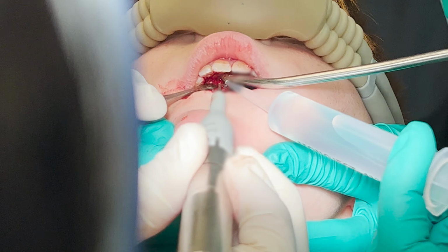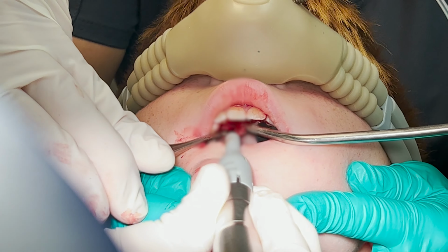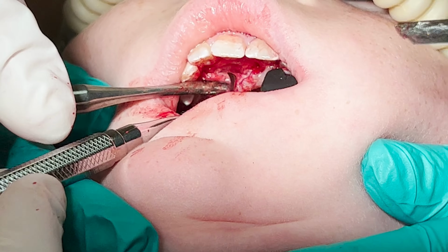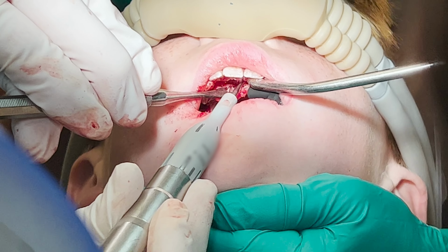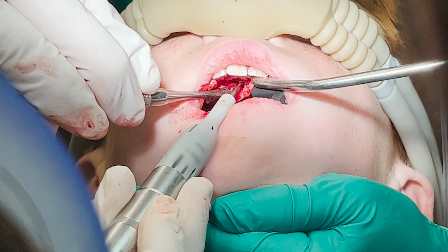Now that I'm seeing it start to come into view, I can start to gently tease some of the bone off with the periosteal elevator and with the handpiece. My goal is to get around the palatal aspect of this crown and then elevate the tooth out gently from there. I need to get around this crown, but I want to stay as superficial as possible to minimize the potential damage to the root structure of teeth 8 and 9.